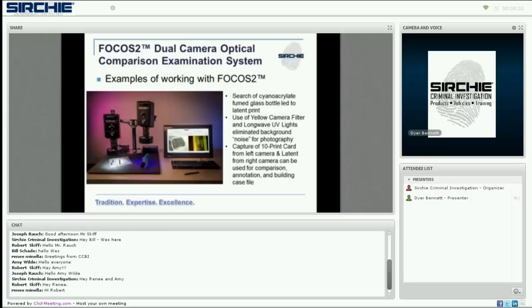In the first example, we were working with a 10-print card through the left camera feed and a cyanoacrylate-fumed bottle through the right camera. We used long-wave UV and the included yellow filter on the right-hand camera to block out background noise and capture a latent print in detail from the bottle, as represented in the right-hand image on the monitor. From there, the captured images can be worked with within the software.